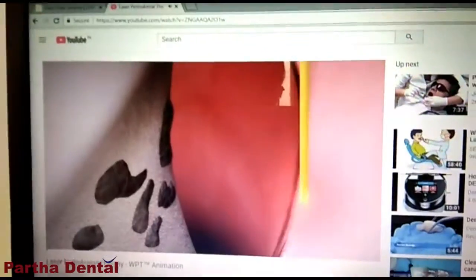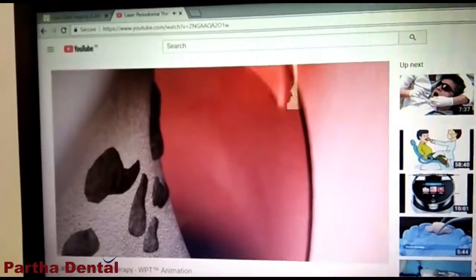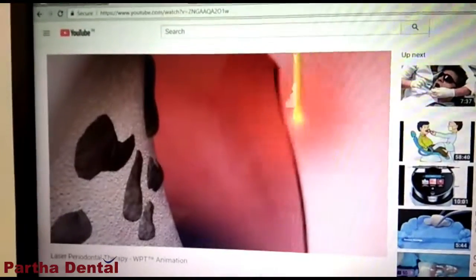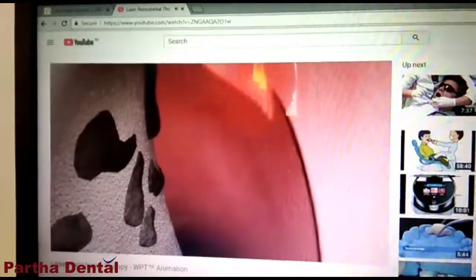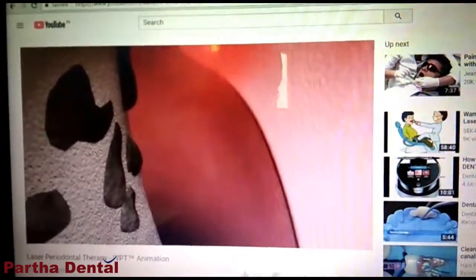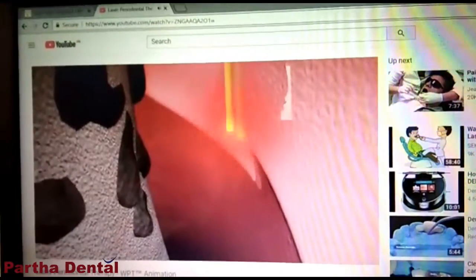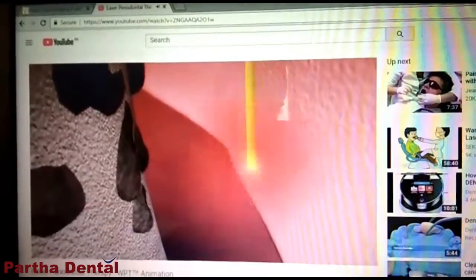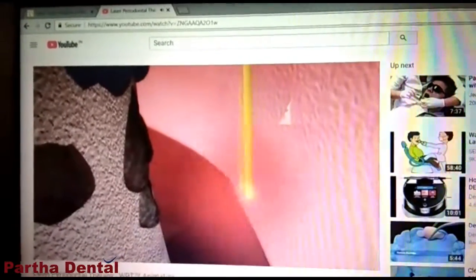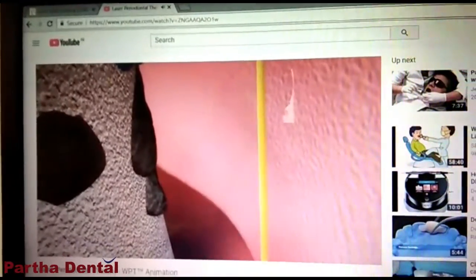Now, I am going to demonstrate the laser light. The laser light works very effectively on the tissue.